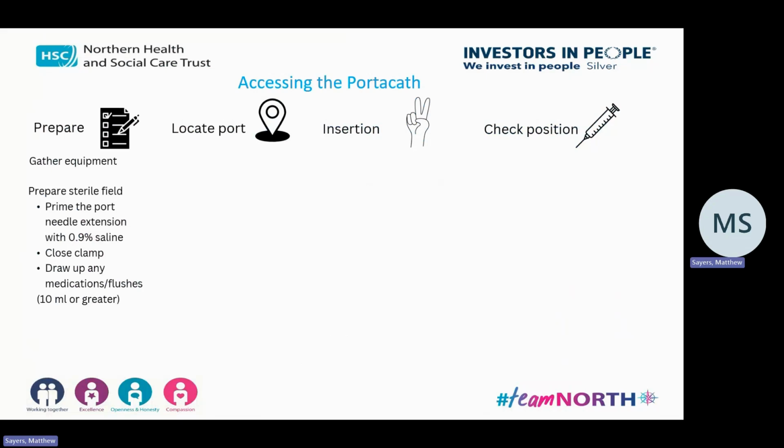So that happens before you do anything else. And then just to highlight that a 10 ml syringe is the absolute smallest you'd ever use, just because of the issues with pressure blowing the catheter. So 10 ml or greater in regards to the size.